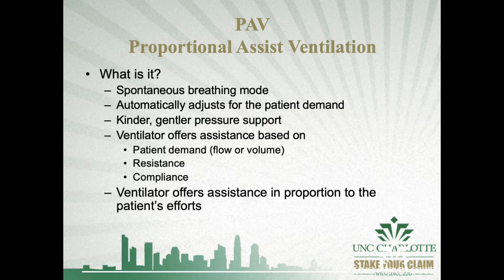of interesting, and I've used it in situations where we really couldn't figure out how to make the patient comfortable. And in those situations, it didn't work well because we as clinicians did not know how to use it. But with some practice and time and understanding, I learned how to use this mode of ventilation. Does that mean it's a good mode of ventilation? Who knows? Sometimes these things are created to fix a non-existent problem.